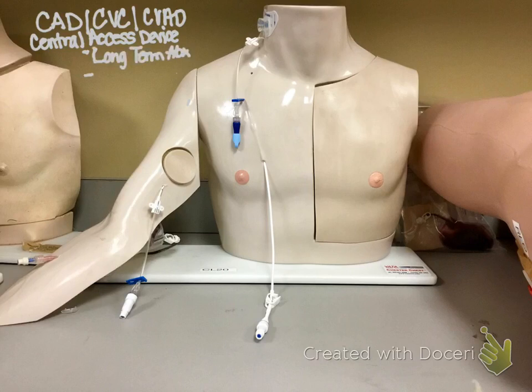What are they used for? Why would one need a central line? Well, often a central line will be used for long-term antibiotics. Anyone that you think may need long-term antibiotics will often get a central line just to prevent the patient from having to be stuck so much. Same thing with vesicants. Vesicants such as chemo are really hard on the veins, and you don't want to hurt anyone, so often they'll have a central line.